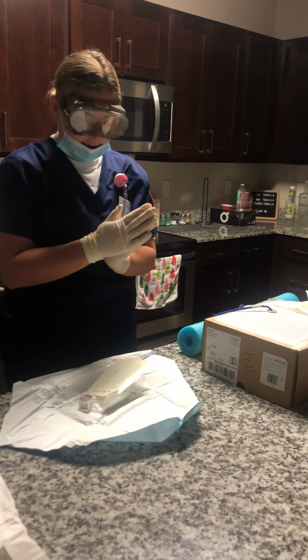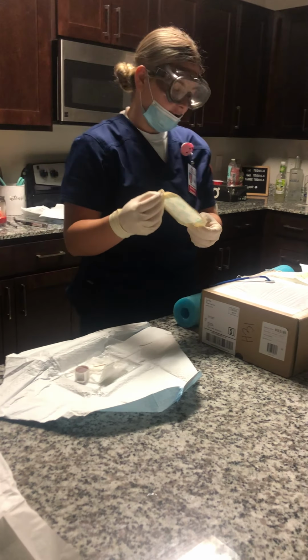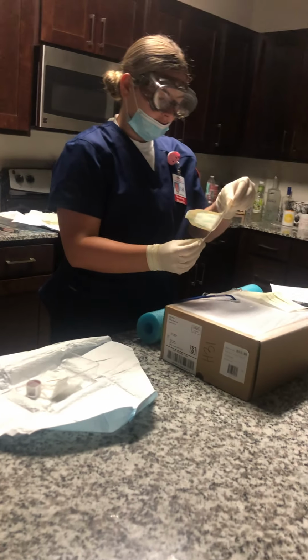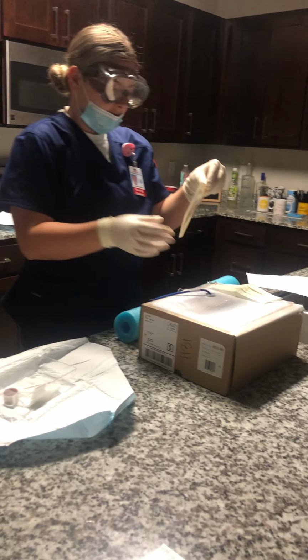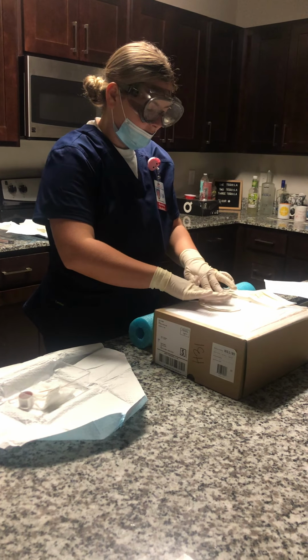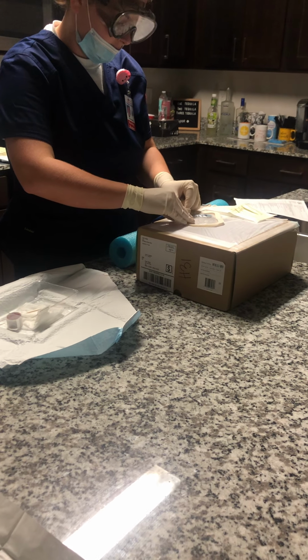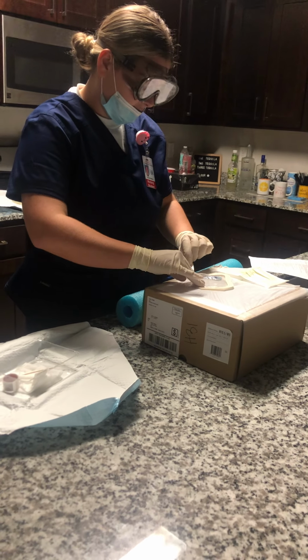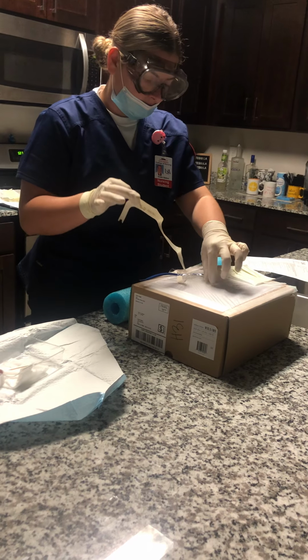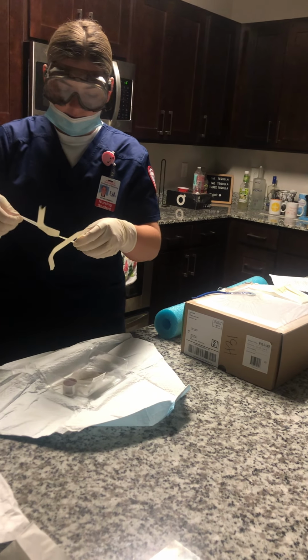So now that his bio patch has been applied, I will now apply the Tegaderm. That's how I'm going to apply the Tegaderm. So dispose of that. So making sure to get everything covered with his Tegaderm. And his Tegaderm has now been applied. So I'm going to remove the border. So now that has been removed, I have this sticker. I'm going to dispose.